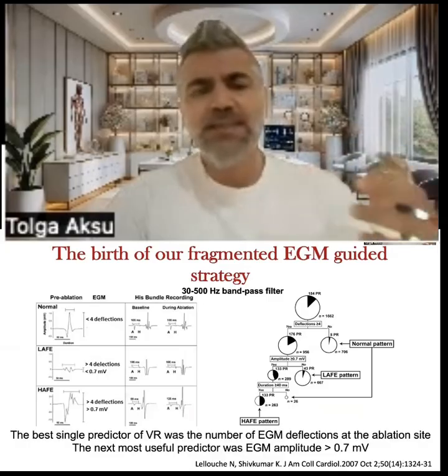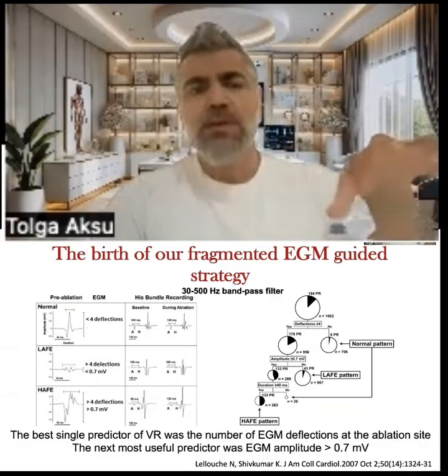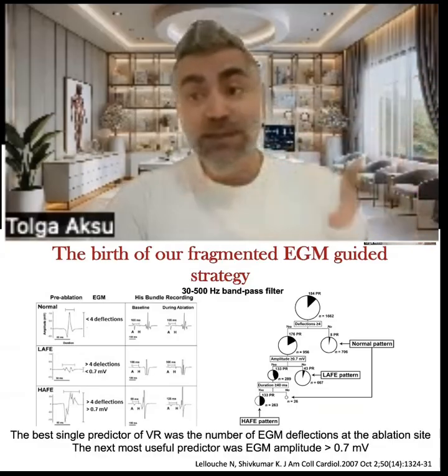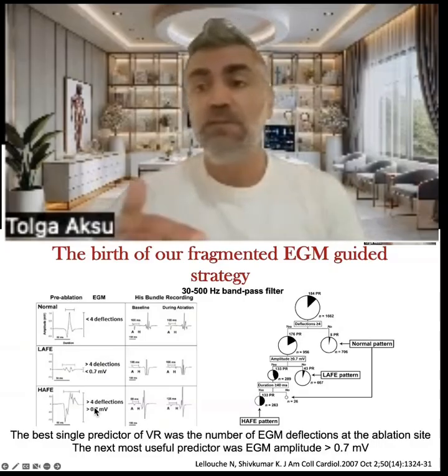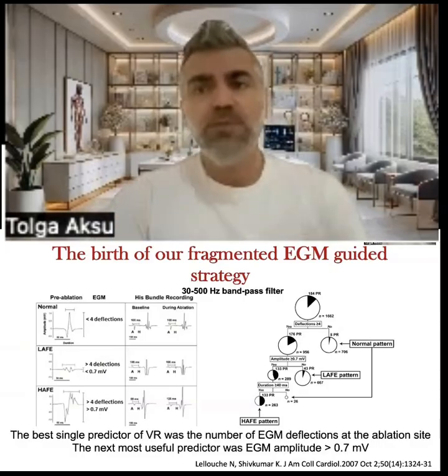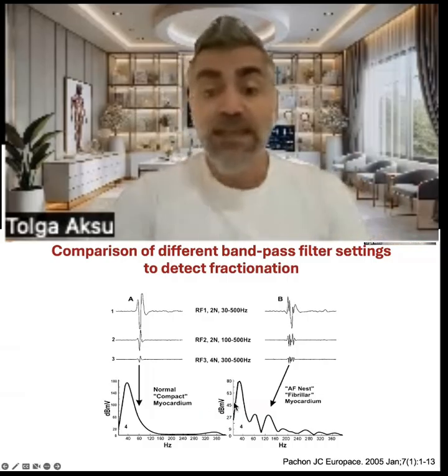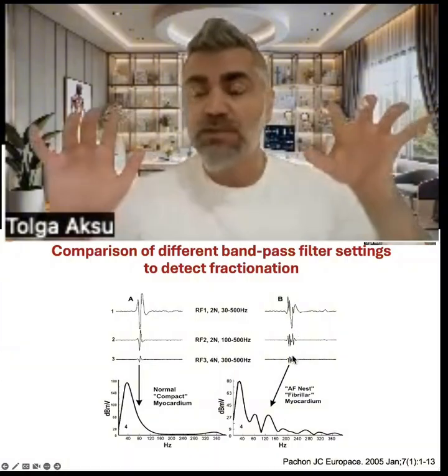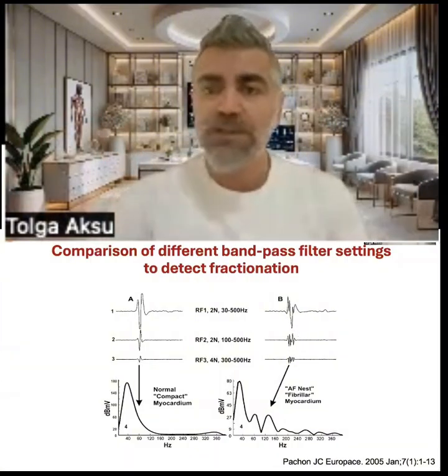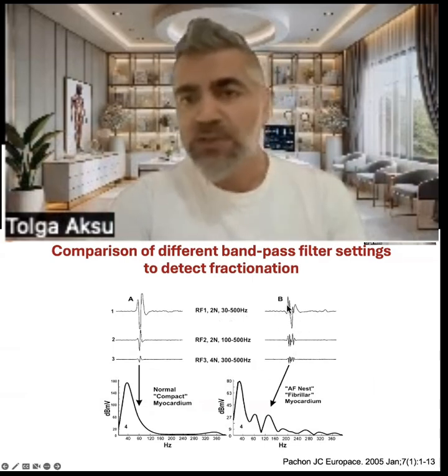According to this basic study, Laluce performed divided electrogram characteristic based on vagal response during RF application, and they found that if you see more than 3 or 4 deflections on electrogram, you will see more vagal response like high frequency stimulation. And then Professor Pachon compared different bandpass filter settings to calculate the real number of fragmentation on electrogram. Look at that. If you use classical electrophysiological parameters, you can miss such a fragmentation on electrogram.